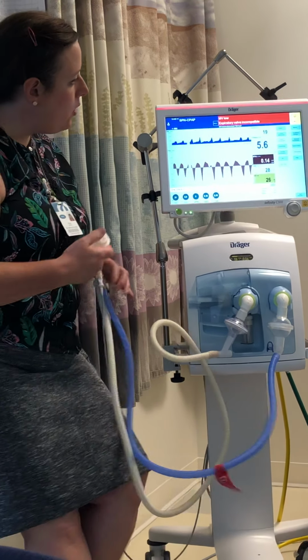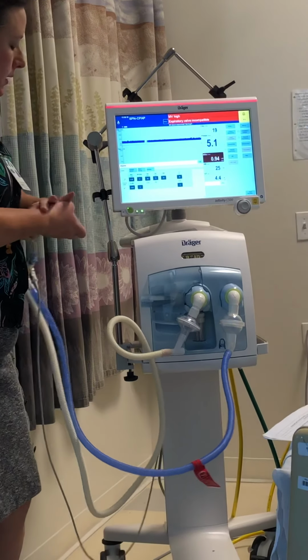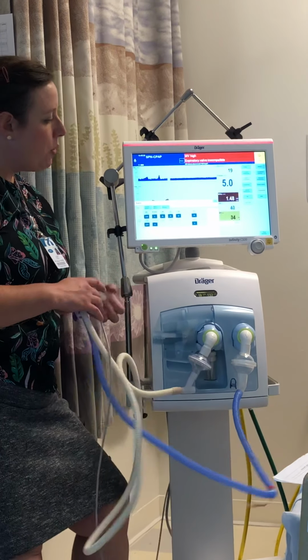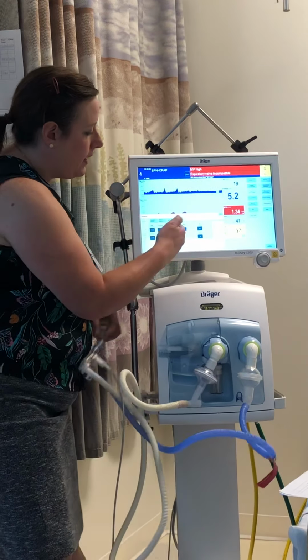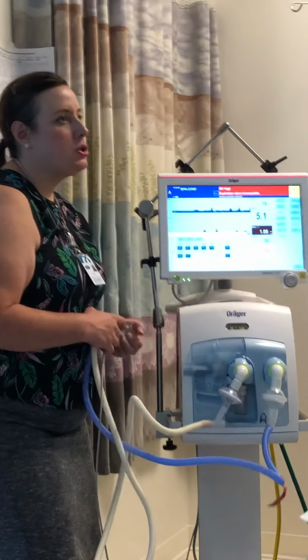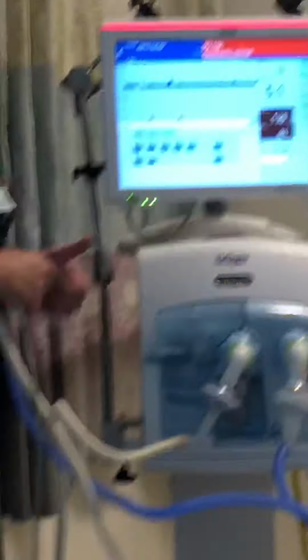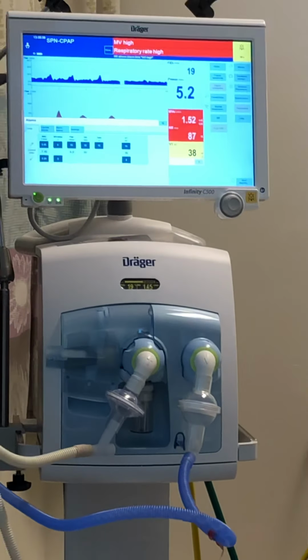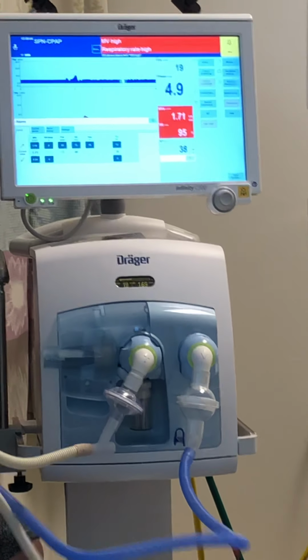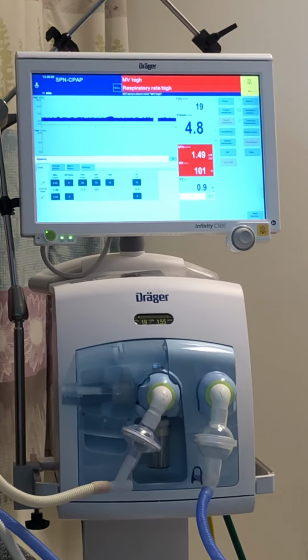Okay, so we'll go into alarms. On the alarms, in general, as a working practice for CPAP in the NICU, most of the alarms are off except for the apnea and then the pressure, because we want to make sure that we're continually applying the pressure that we want to have applied. Frequently, people will shut off all the other alarms because the tidal volume and the minute volume can be significantly lost from the patient's mouth. We don't have a complete circuit, since the prongs only take up 60 to 90% of the nares, so you can get significant leakage from there.